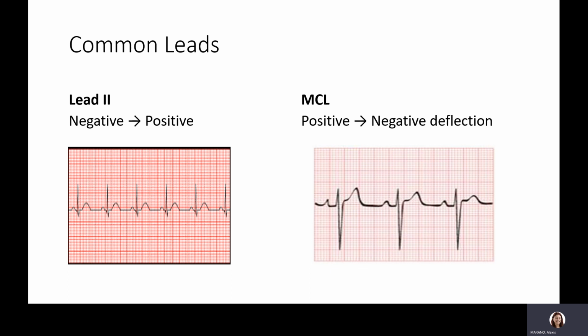If you had someone tell you, stand at the foot of the bed and tell me everything you see about your patient, you might miss a couple of things, like behind the ears or the very top of the head. So if you're able to change your position, your view, and maybe stand at the head of the bed and look down, you'd have a different perspective. Now we can keep changing our perspectives and turn our patient over and go on the other side of the room, but then that's a 12-lead class, and we're not talking about that today. We're just talking about our 2 most common leads.